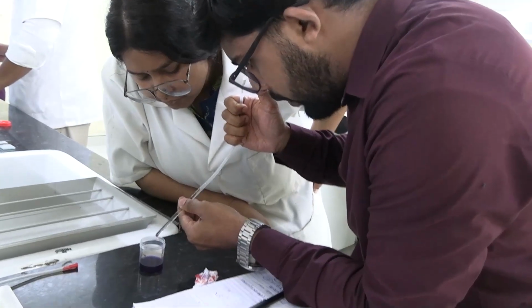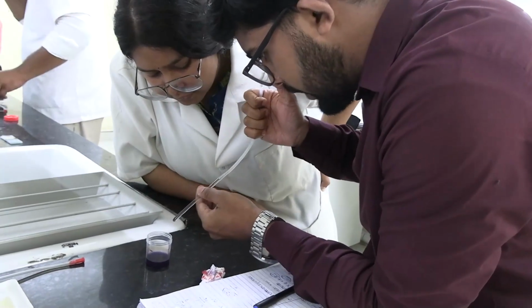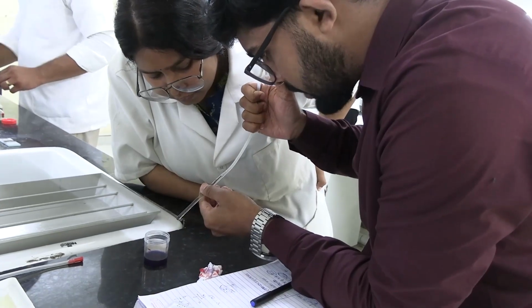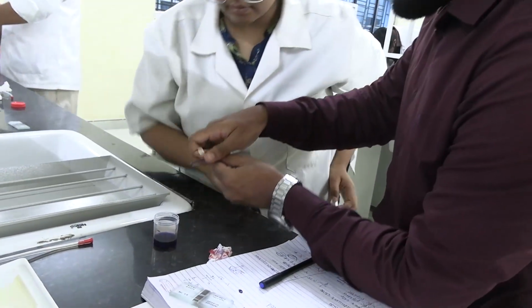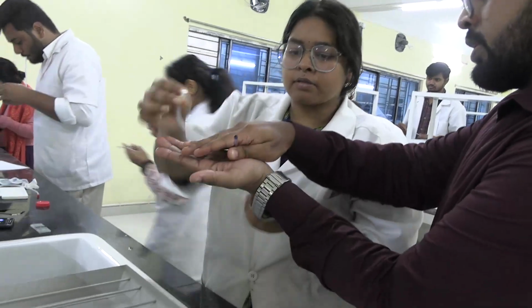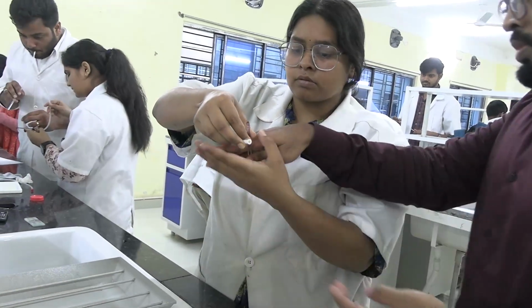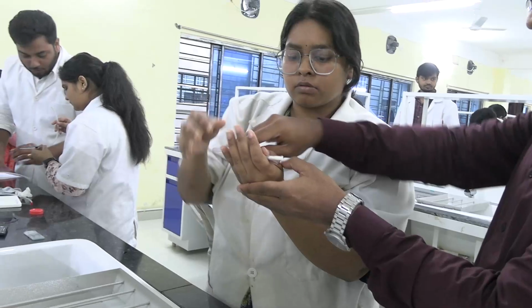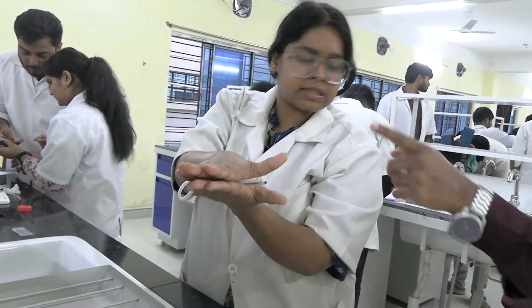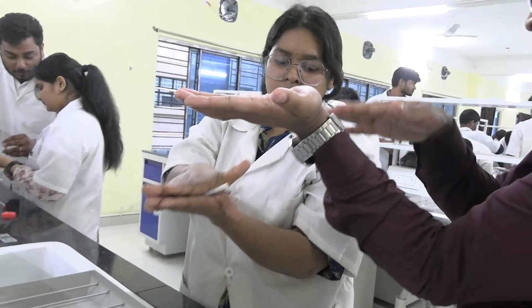You have to keep an eye on your pipette so that it comes to 11. Draw any excess fluid, please come to 11. Now keep it like this and mix for 2 to 3 minutes. Don't do it like this, otherwise it will go to the center of the bulb. Keep it horizontal, okay?